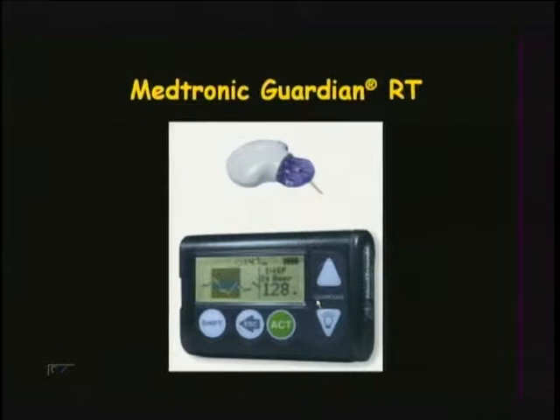And you can see a little bit closer what this looks like. This is an insulin pump. I should point out that this particular meter also works as a standalone device without an insulin pump. So this is called the Guardian. From the outside it looks the same, but no insulin is actually provided.